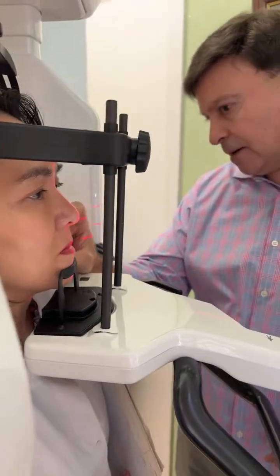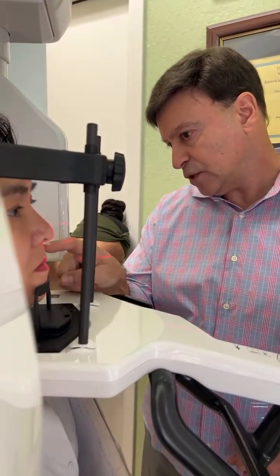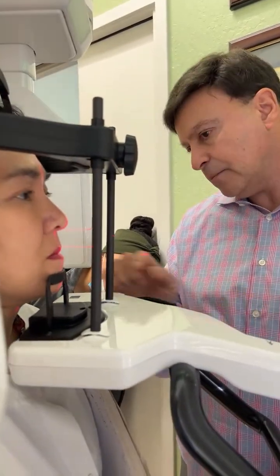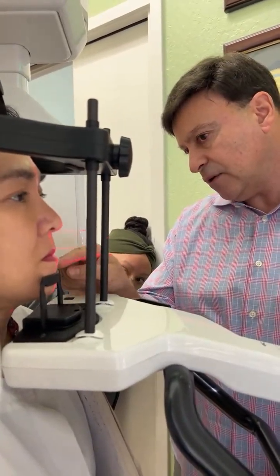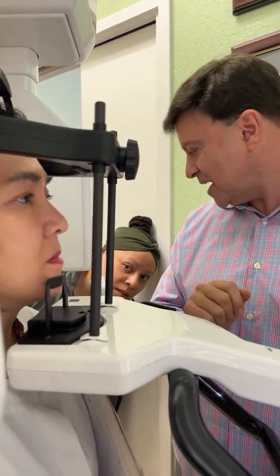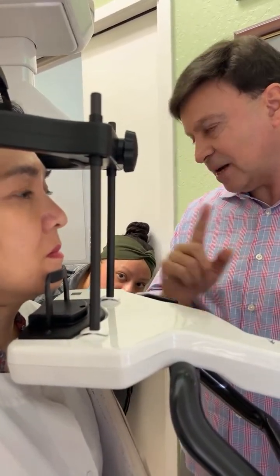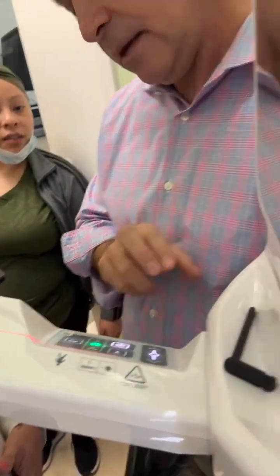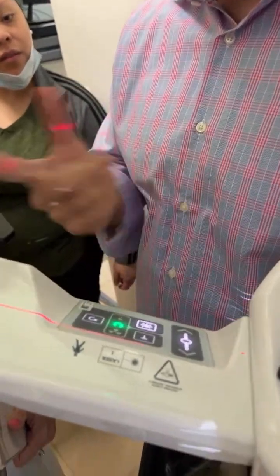And you see where the lights are? So that's the top of the image we're taking, and the lower one is under here, under the inferior border. But we have a long way to go, and for her, we wanted the maxilla, didn't we? You're not really catching much of that, are you? You're not going to be happy with that. So the lights go off. I'm going to turn it on again. Where do you turn on the light? Right there. They stay on for 30 seconds.